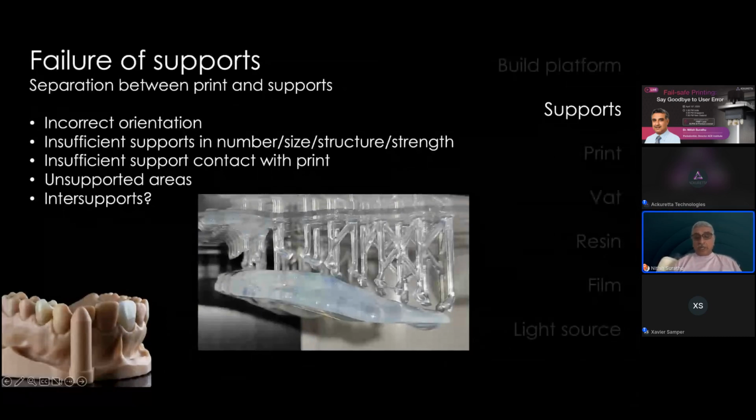It can also be because the contact angle between these supports is not set to a wide enough radius, and that in fact can also cause a failed print. You can also have unsupported areas of a print.